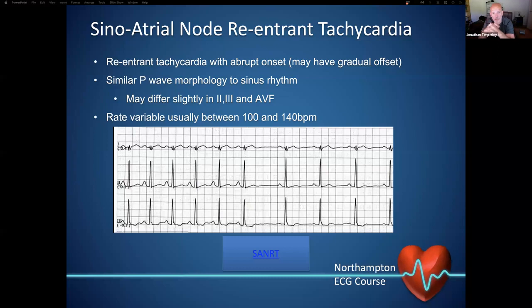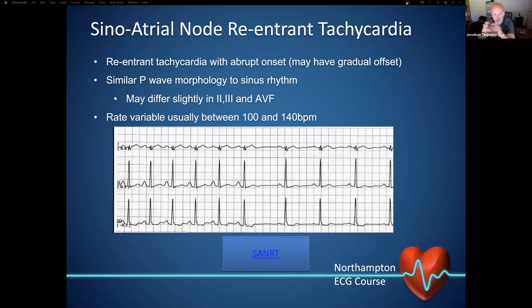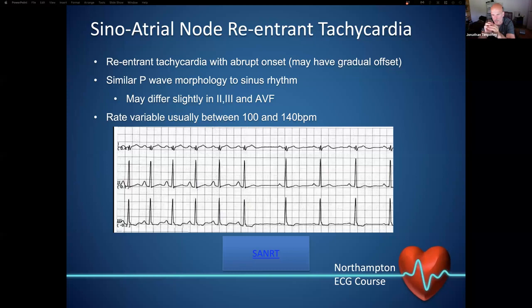Let's start with sinoatrial node re-entrant tachycardia. This is a re-entrant tachycardia, so it starts with an abrupt onset. It may have a gradual offset, and generally, because it is around the SA node, we end up with a very similar P wave morphology to those in sinus rhythm. There may be some minor differences when we look in leads 2, 3, and AVF, but generally it ends up with a very similar morphology to sinus rhythm.